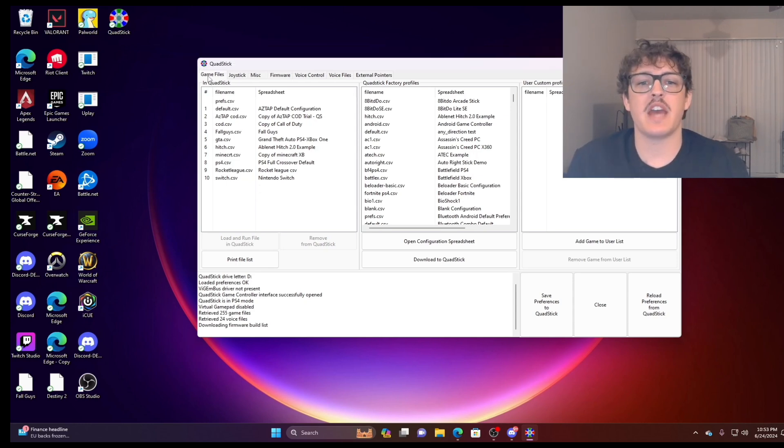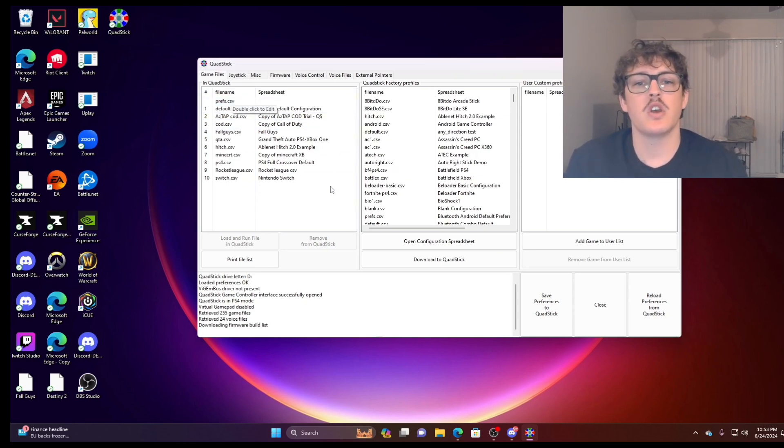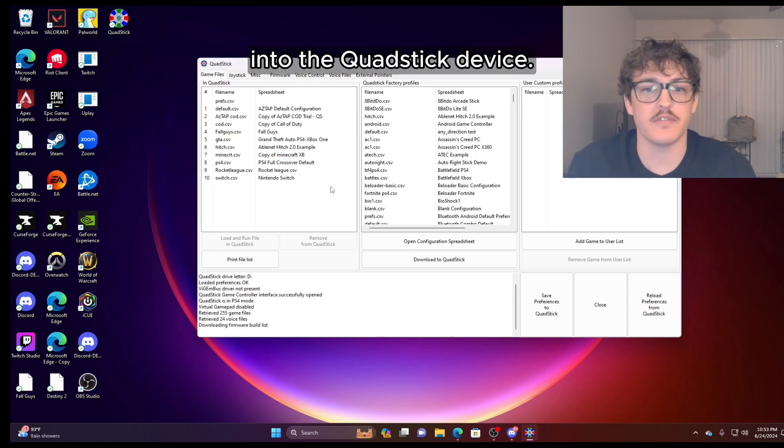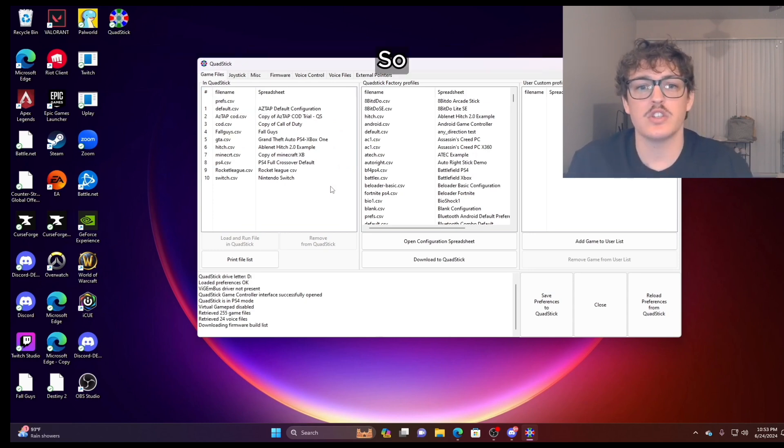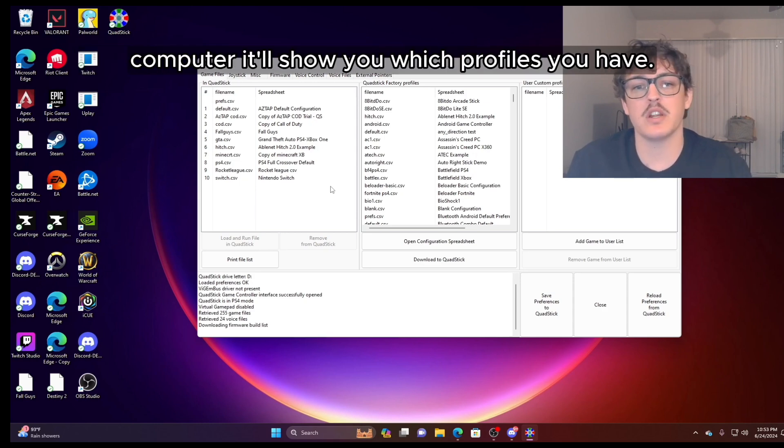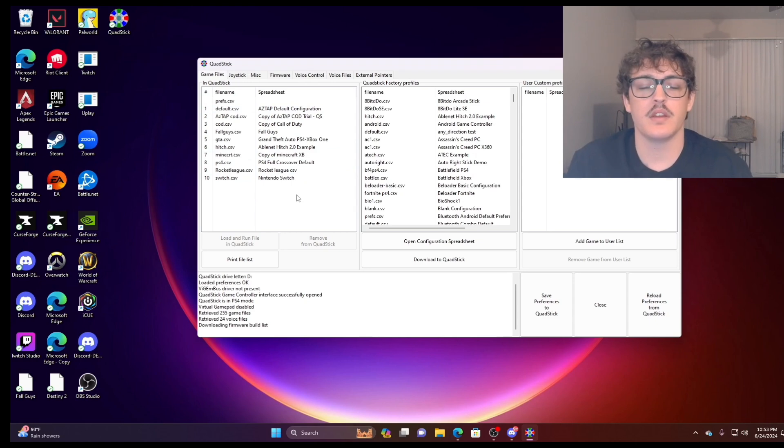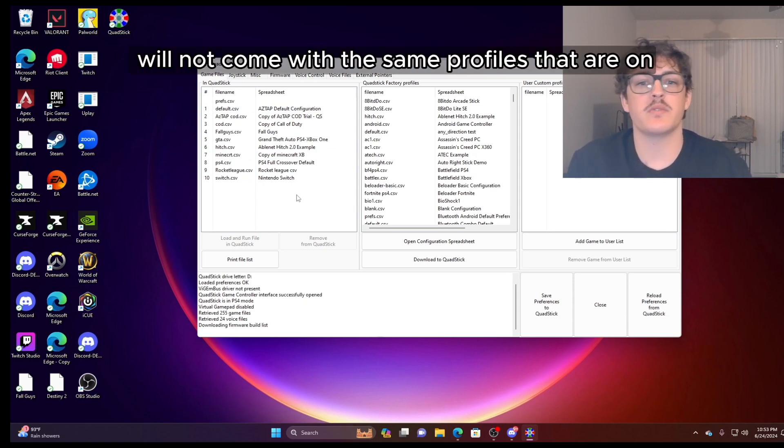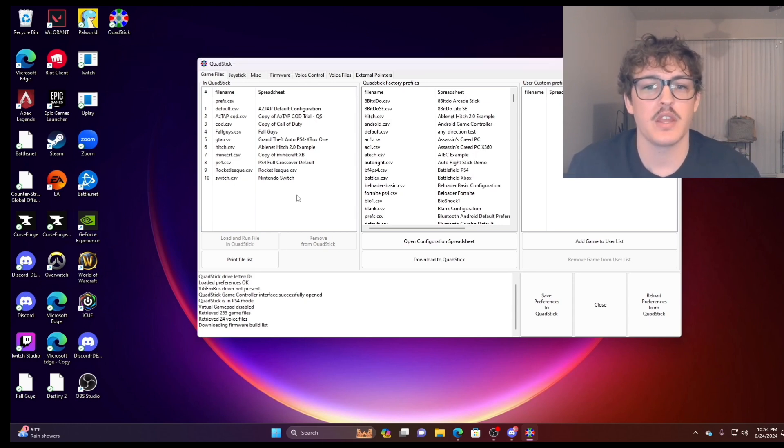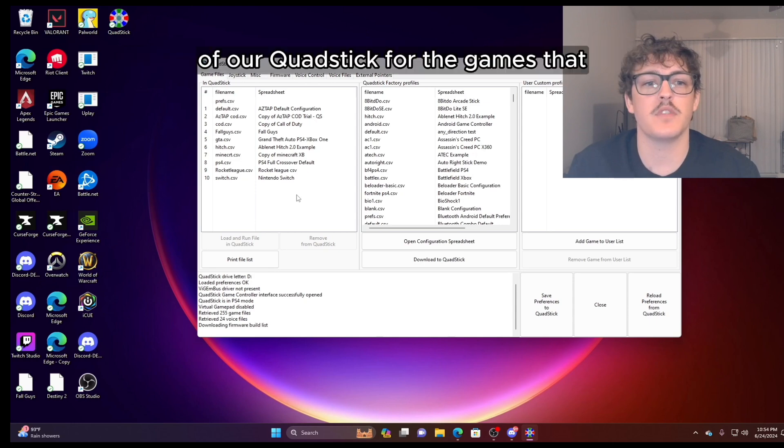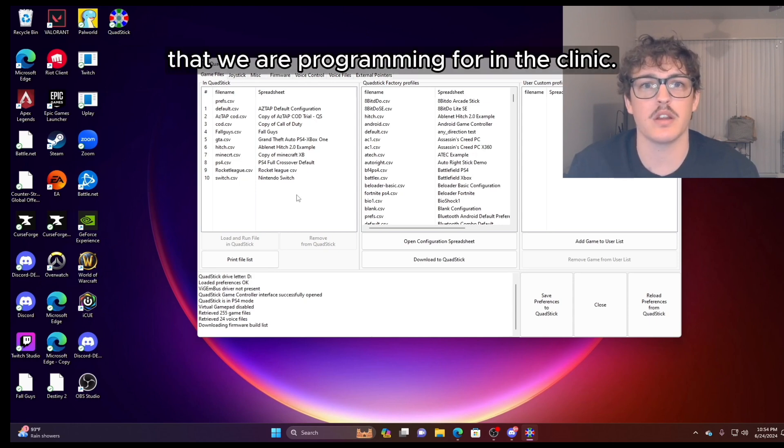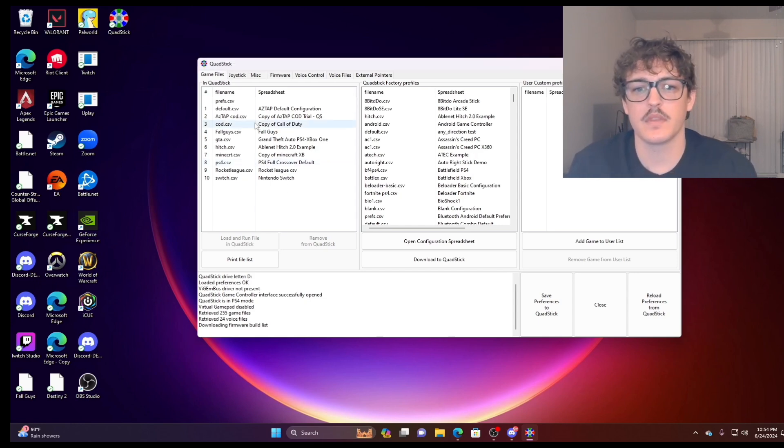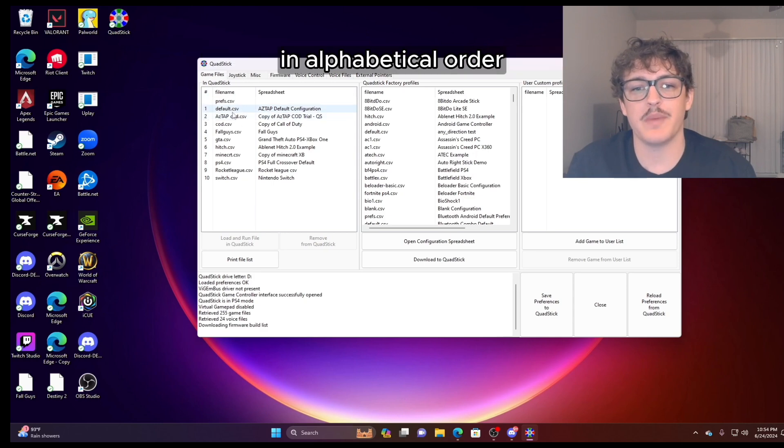In the game files tab, this is going to list all of your profiles or the controls for each different video game that you have coded into the QuadStick device. So when you connect the QuadStick device to your Windows computer, it'll show you which profiles you have. Now it is important to note that your QuadStick will not come with the same profiles that are on the QuadStick that I'm using here. We've been tweaking and modifying the controls of our QuadStick for the games that we're programming for in the clinic.